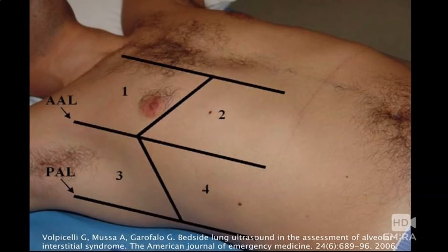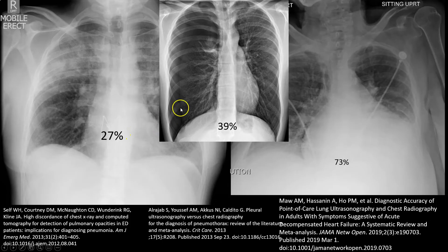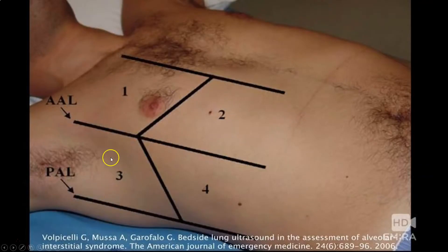There are a lot of ways to scan the lungs — a hundred different protocols you could choose to follow, each with their own slight variation. The simplest approach, generally used by most of the clinicians who will be teaching you, splits the lung into four zones. The split happens around the sternum to the anterior axillary line, subdivided just below the nipple line into zones one and two. Then zones three and four are separated by the posterior axillary line.